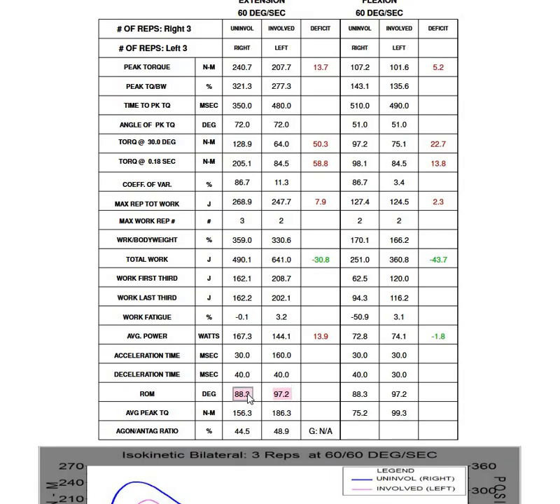Now you might think, well, what does that matter? But it matters a lot when we think about how we interpret these work values, which is another reason to consider work more of a relevant measurement for a higher angular velocity test with more repetitions, because it is more likely that your participant is going to, say, cheat the test. That seems harsh, but whether they consciously or unconsciously mean to do it, they may shorten the range of motion with a more challenging test.